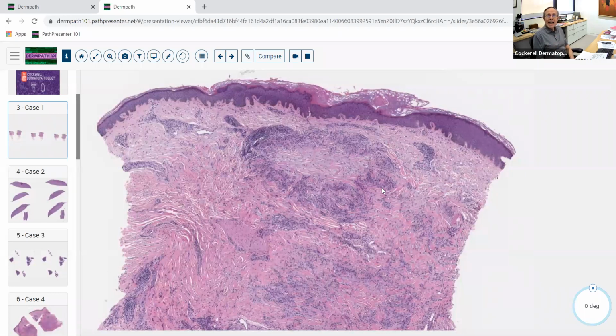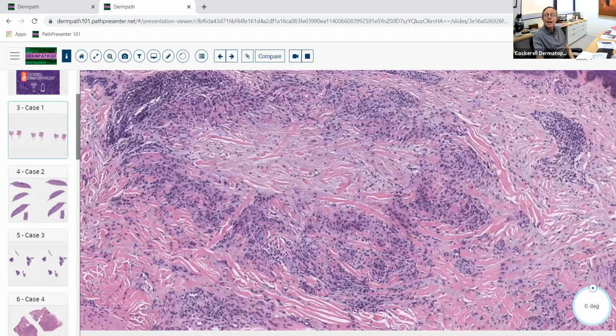And when you think about palisade, if you go back in time to the days of Davy Crockett and Daniel Boone and Fort Ticonderoga and all that kind of thing, a palisade refers to the picket fence, if you will, the spikes in the ground that go around the fort. So if you look at a palisaded granulomatous dermatitis, you're going to think of this as the little logs with the sharp points on the outside that are sitting around here. And then the center is where the guys would hang out with their families, and the military would be in there, and they'd be protected from the Native Americans out here, and they're inside the fort here. So they're all safe when they're in here.